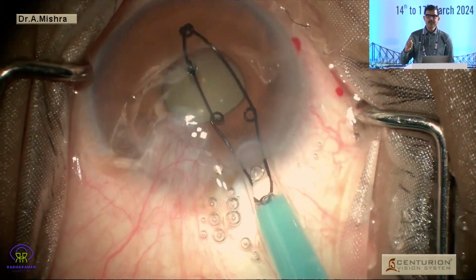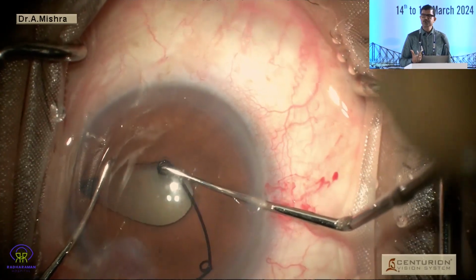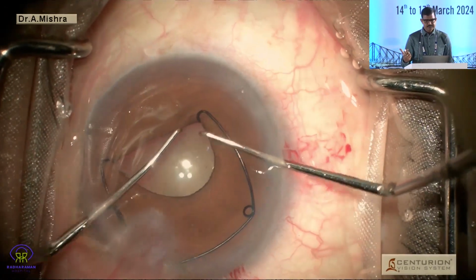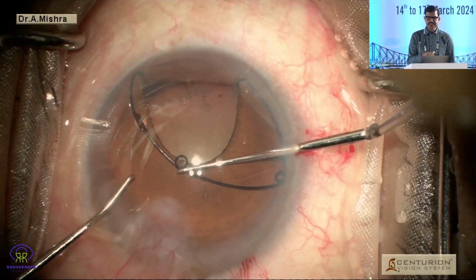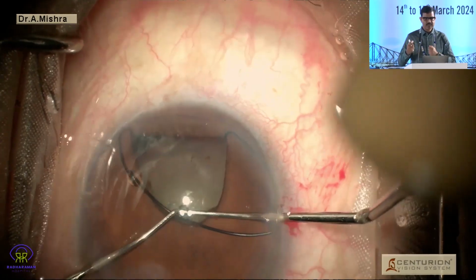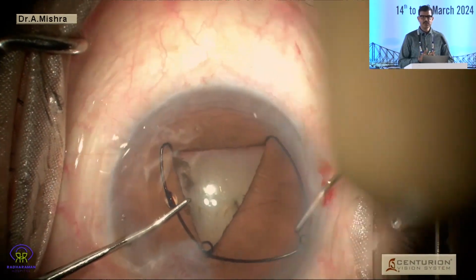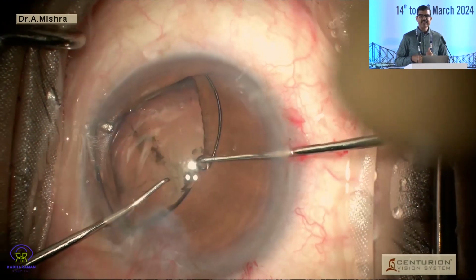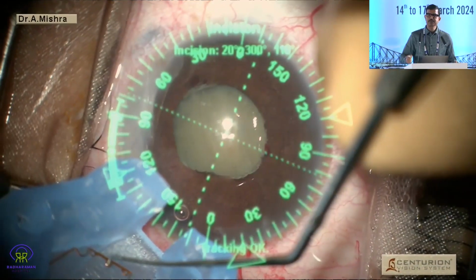The Gupta's ring is an Indian counterpart of similar design. The only difference with this is you need a 2.8 millimeter section for this device to go in. It doesn't go through a 2.2. And then the other thing is, it has a joint in one of the flanges. You can see that on the left-hand side, and that joint sometimes just snaps open. So just have to be careful. And it's not as malleable as a Mulligan, so engaging it is slightly more difficult, but it does the job and is more economical when the price point comes in.